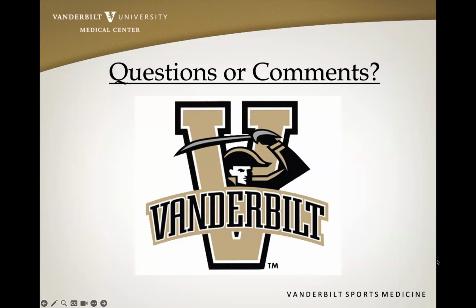I was just curious, digging in a little bit more about Stephen, how you're doing the dynamic scan. I'm kind of like Brendan. Of course, we practice together now, but I tend to use the squeeze method more often.